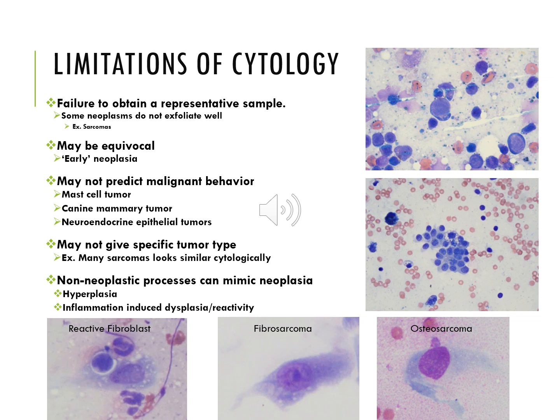Another issue is that we can frequently, but not always, determine which tumor type is present. By type I mean sarcoma, carcinoma, or round cell tumor in the greater categories, but we can't determine which specific tumor type within those greater categories is present.